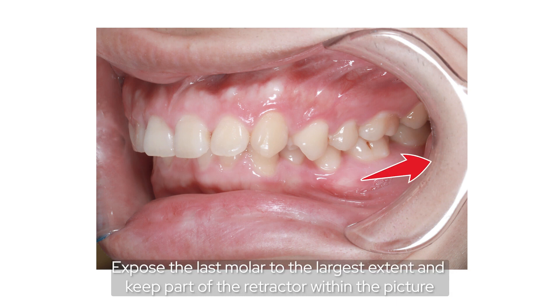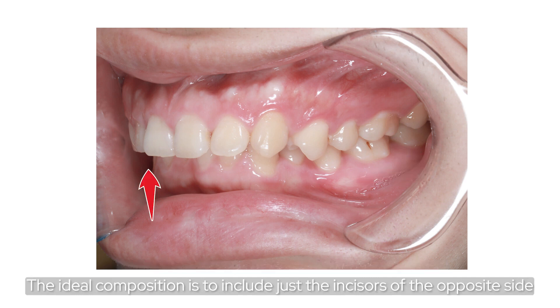Expose the last molar to the largest extent and keep part of the retractor within the picture. The ideal composition is to include just the incisor of the opposite side.